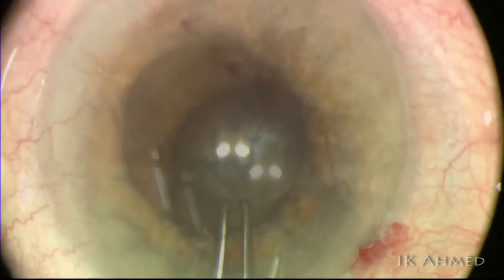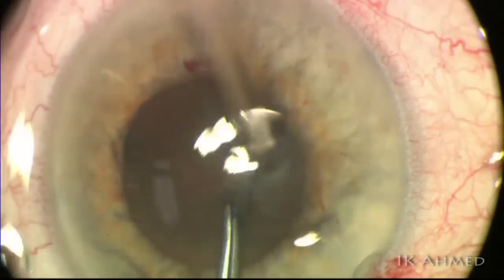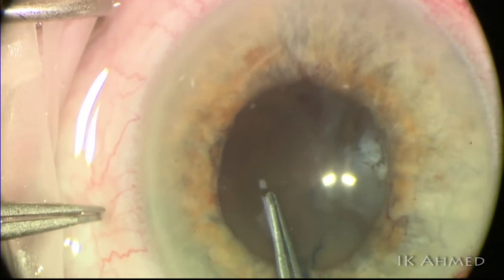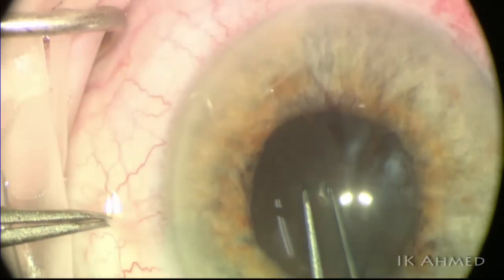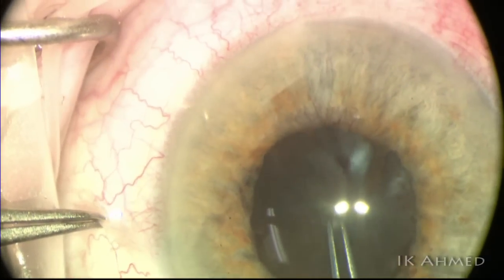Notice the capsule flap here — it is very, very thin. It actually breaks apart and falls apart, as you see here. In this case, the patient had evidence of capsular splitting phenomena, or true exfoliation, where we had a split of the anterior capsule and the superficial capsule was grasped and torn initially.